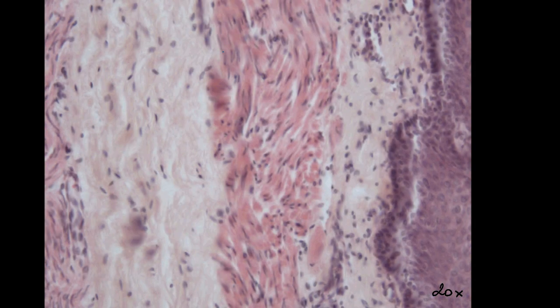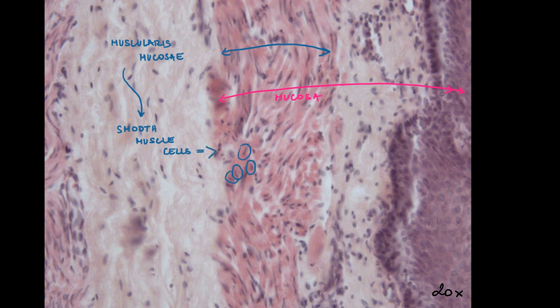Muscularis mucosae is a thin muscular layer of smooth muscles. It divides into 2 parts, internal circular and external longitudinal, in the lower section of the esophagus.